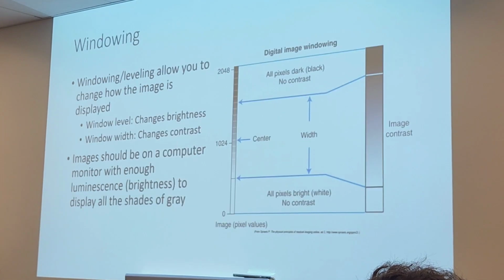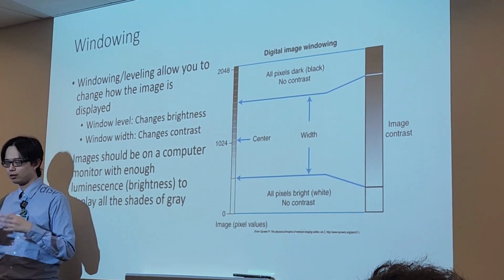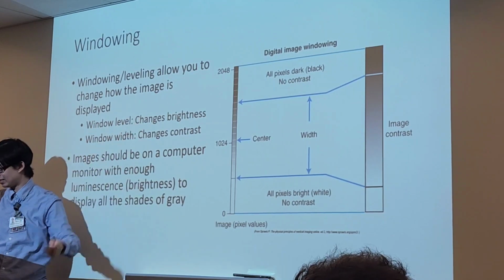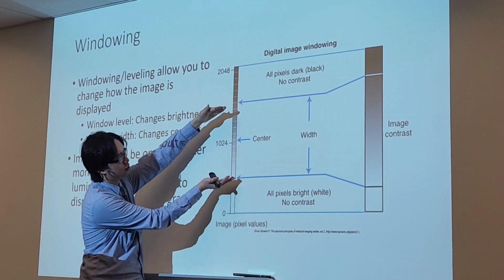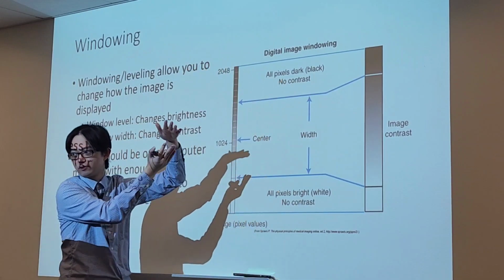Right, so we'll go ahead and keep talking for now. Windowing. What did we say? Windowing changes brightness? That's leveling. Oh, contrast. Contrast. Great. So window width, windowing, is contrast; leveling, window level, is brightness. Right, so windowing is changing the contrast. We've got a narrow range of colors, and you just expand your range of colors or narrow your range of colors.